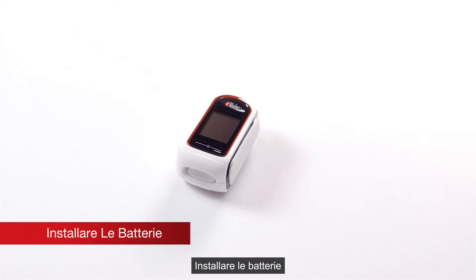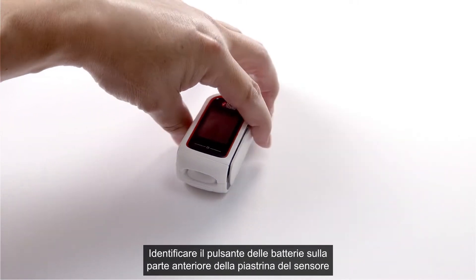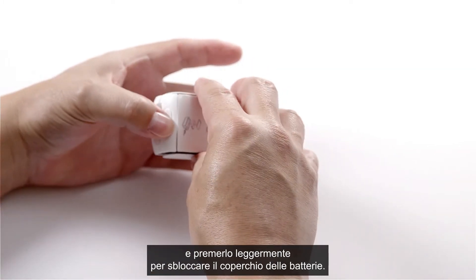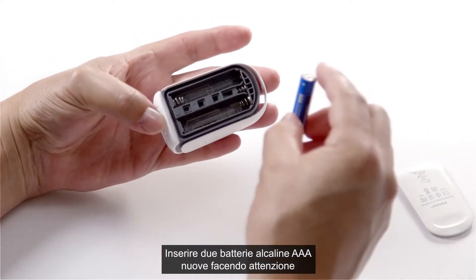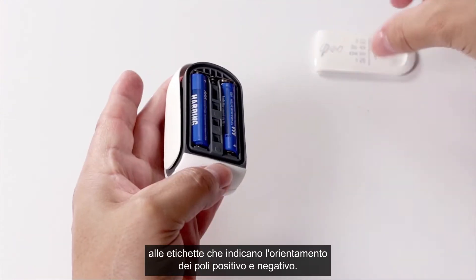Battery install. The MightySat RX requires two alkaline batteries to operate. Locate the battery button on the front of the sensor pad and push lightly on it to release the battery cover. Insert two new AAA alkaline batteries and carefully match the orientation labels, positive and negative.